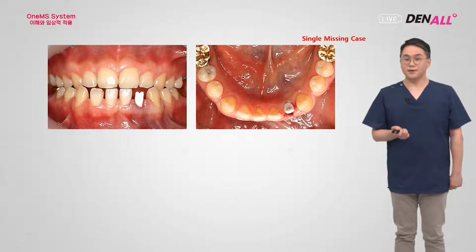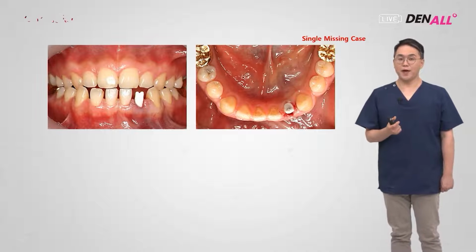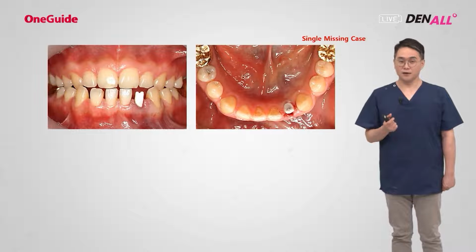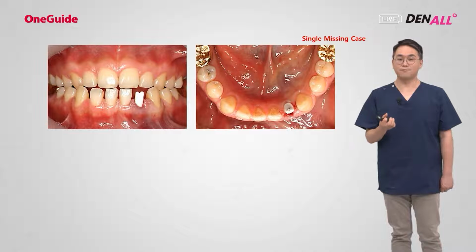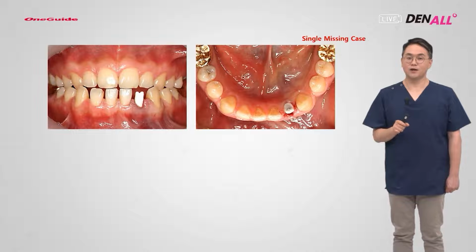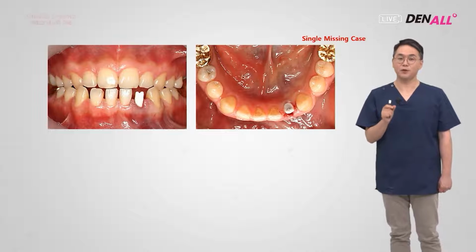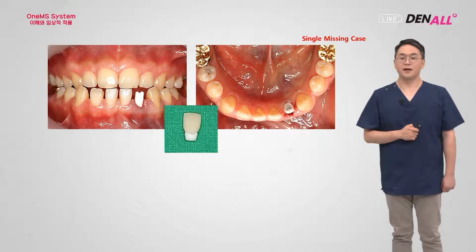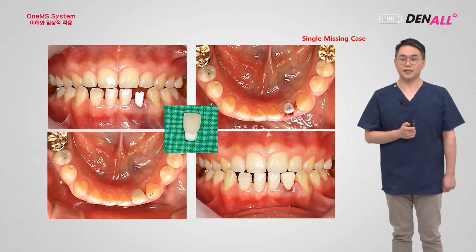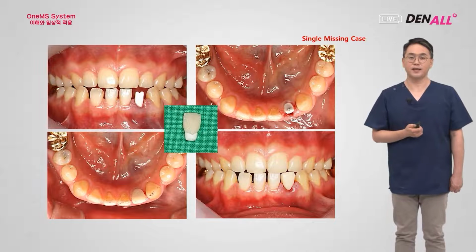As you can see, after placing the MS implant, this is a one-body implant, so a provisional cap is used. The temporary crown is cemented onto the provisional cap. In other words, you don't cement directly to the abutment area of the MS implant. So like a clip-on type prosthesis, a temporary prosthesis can be made. Like this, clip-on type provisionals are made and delivered. After that, you wait for gingiva healing and osseointegration.